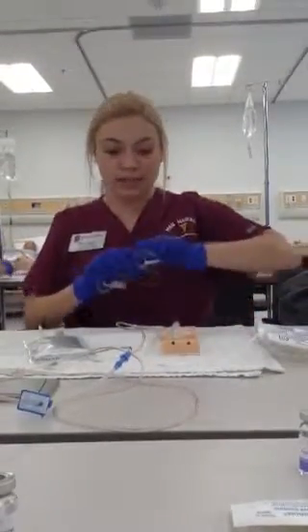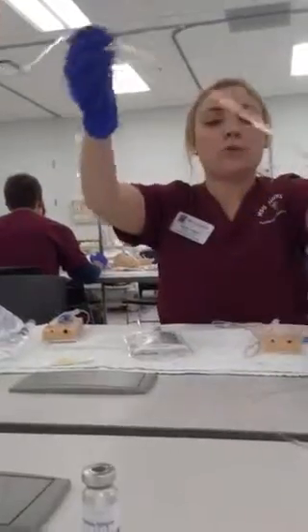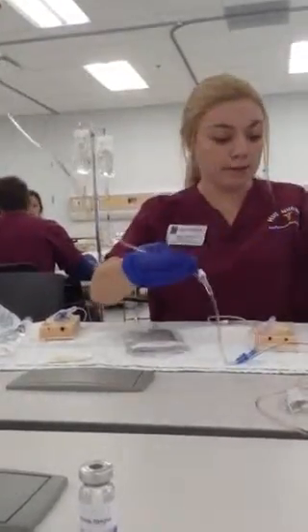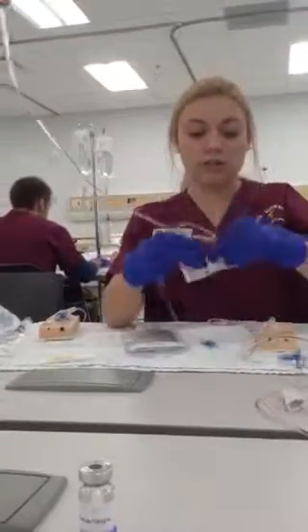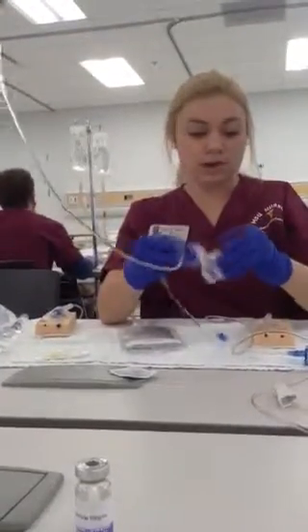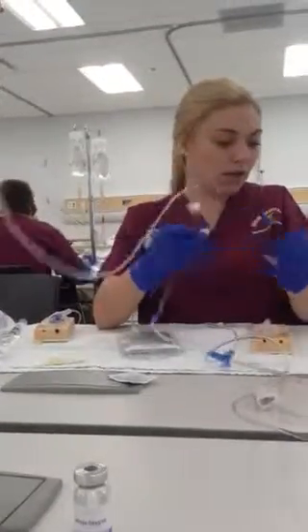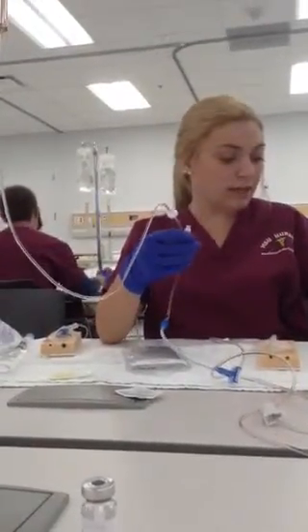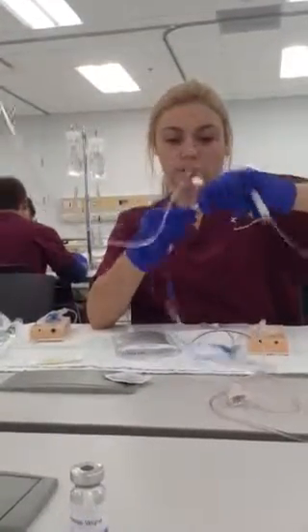we'll get out our secondary tubing, and we'll make sure to prime the tubing. So what we'll want to do is find the port that is closest to our bag. This is still sterile. I'm going to clean my port with an alcohol swab. Okay. I'm going to go ahead and attach the extra tubing to the port.